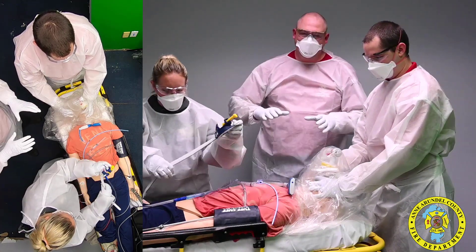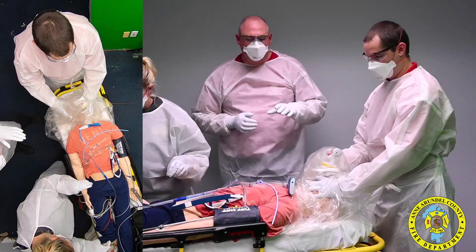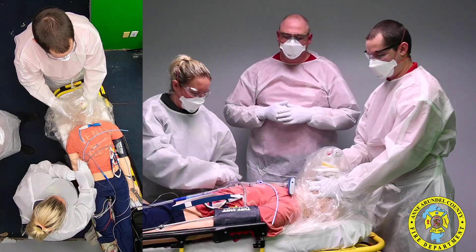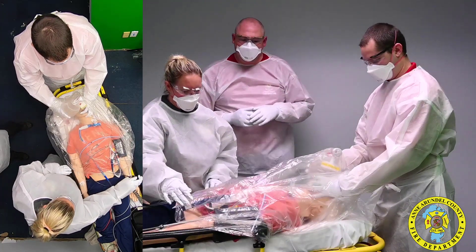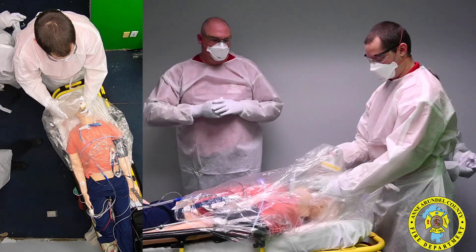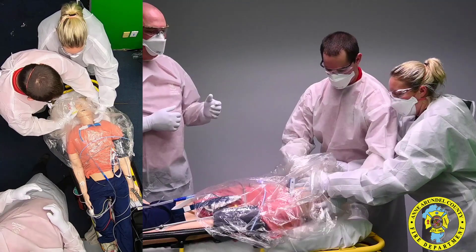In this situation we're setting up for the ET tube. You can see she has her video laryngoscopy and all of her devices set up on the chest. If there is a Lucas device in place, you may need to set up on the side of the patient's head. You can see she is covering her equipment with the protective poncho and then switching positions with the BLS provider.